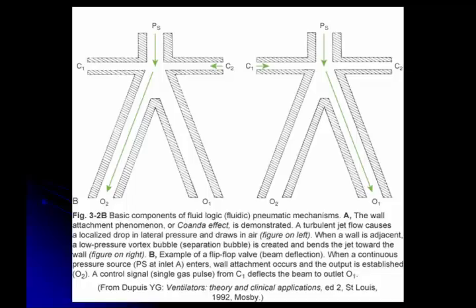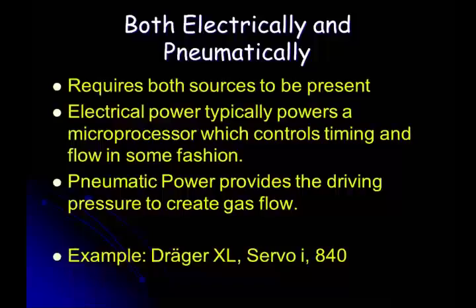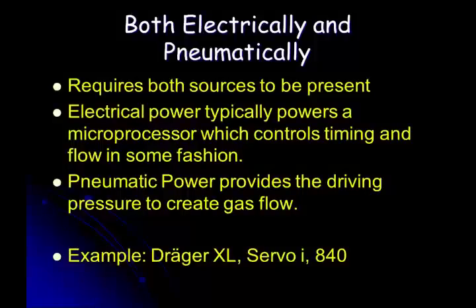This actually is called a flip-flop valve. What a novel name for it. Okay? There doesn't have to be a moving part somewhere? No. It's the most fascinating thing that you see, that the guy came up with.